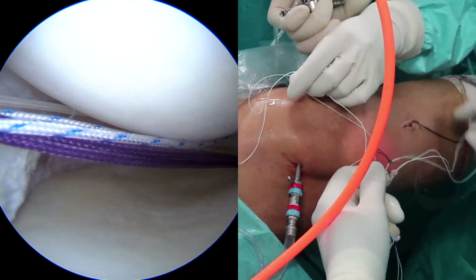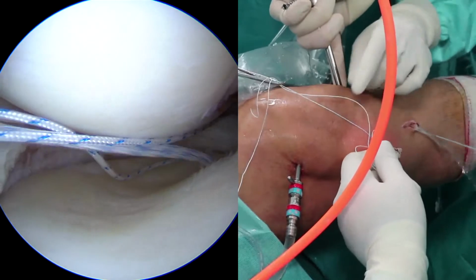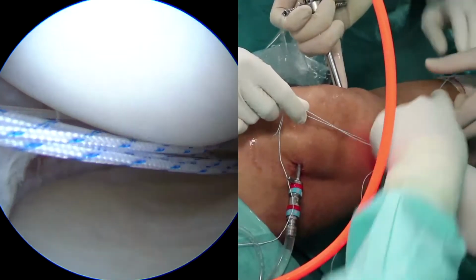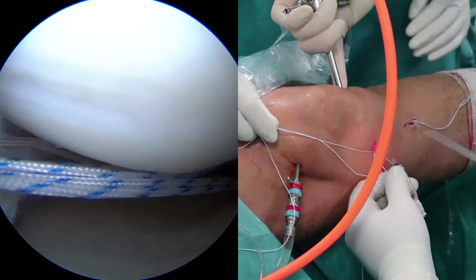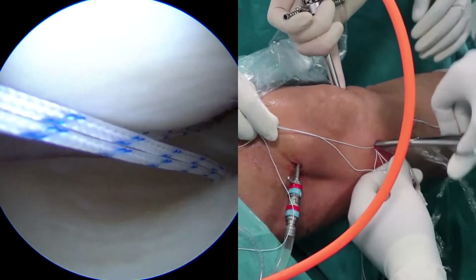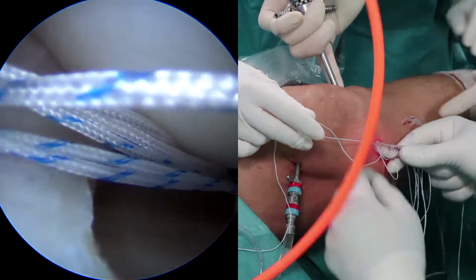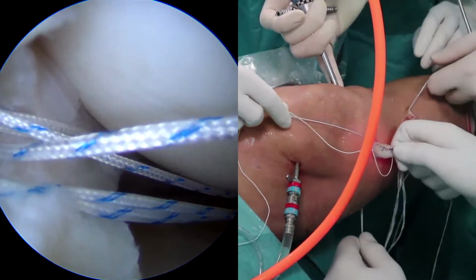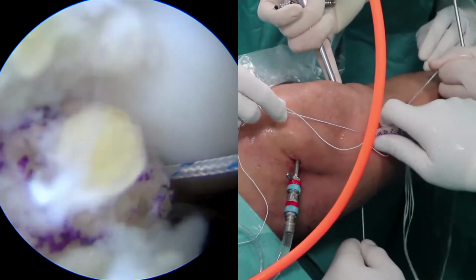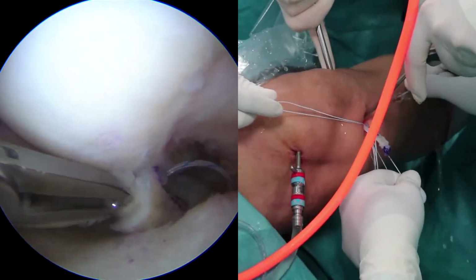When entering the meniscus into the joint, it is crucial to pull the graft at least from 2 separate points to allow a correct positioning and to avoid twisting. If this maneuver is predicted to become difficult, a previous pie crusting of the medial collateral ligament is advised in order to increase the space for the passage of the bone block, as this can be a very limiting step of this procedure.